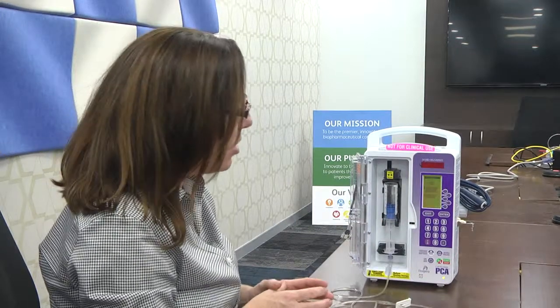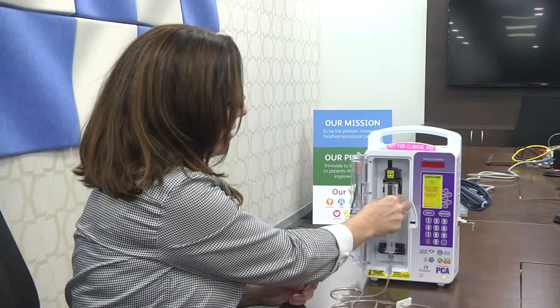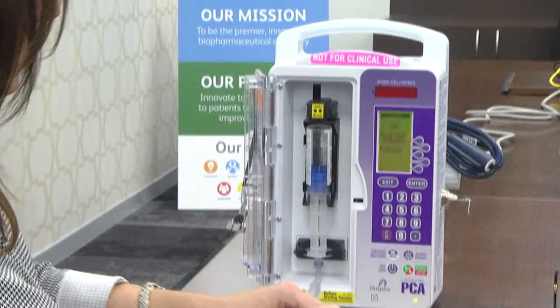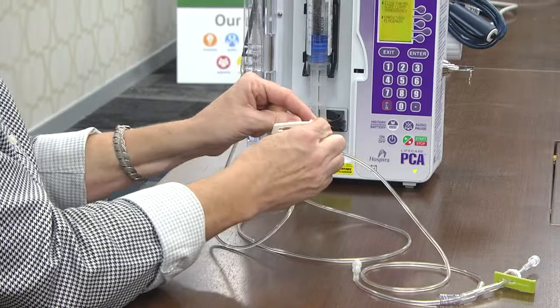The pump is displaying the check vial alarm, which generally occurs when the top portion of the vial is not properly inserted into the cradle. It's presenting some instructions, telling me to close the side clamp, so I'm going to close the side clamp.